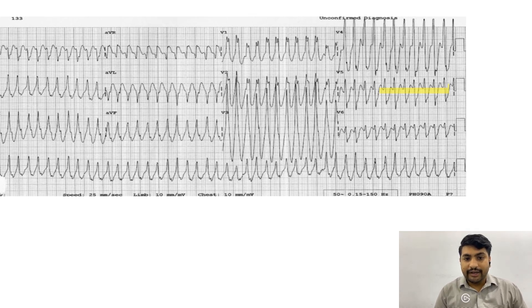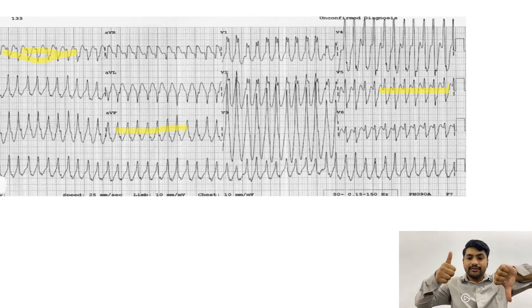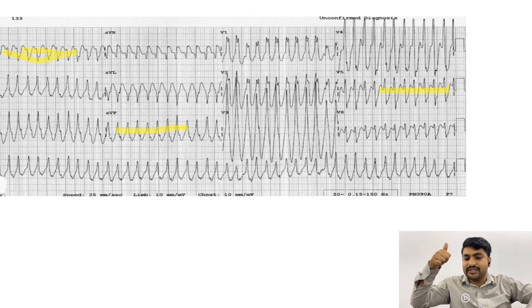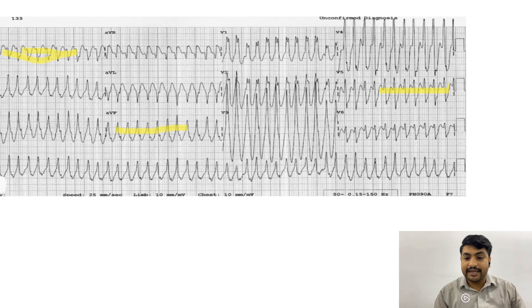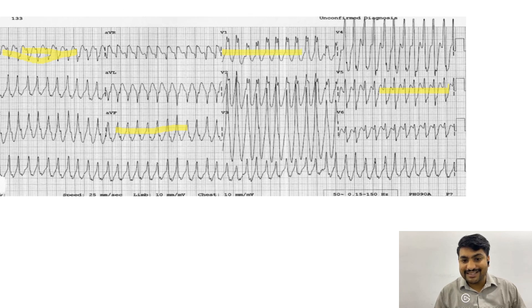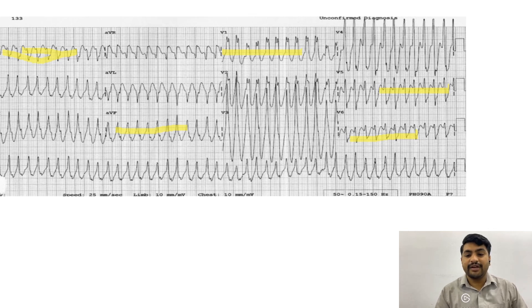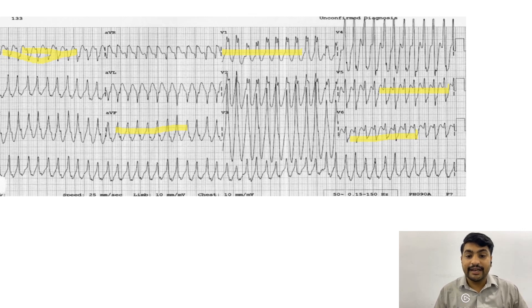Step four examines the morphology: the bundle branch block pattern should not look like VT. Looking at the axis, lead I is pointing downwards but lead AVF is pointing upwards — this is right axis deviation. Looking at V1 and V6, this is a right bundle branch block morphology. So this is SVT with aberrancy, where aberrancy is present when there is some bundle branch block. At the final step we declare this ECG is SVT with aberrancy.